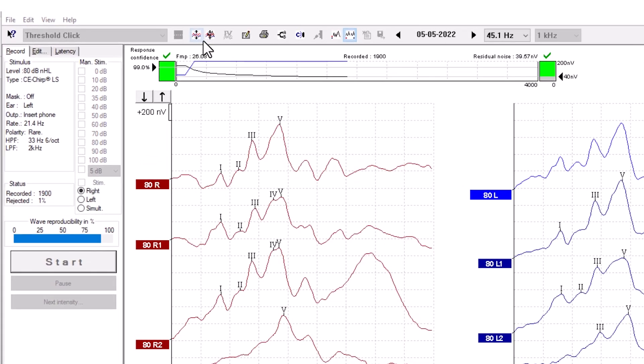This button is the auto-arrange curves button. This function arranges curves during testing for a cleaner look.